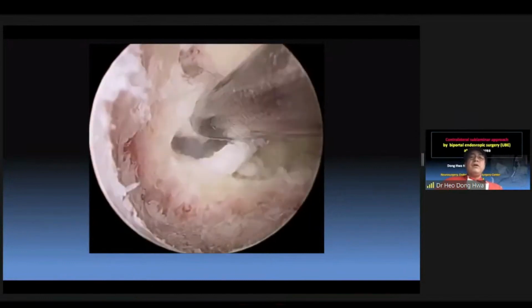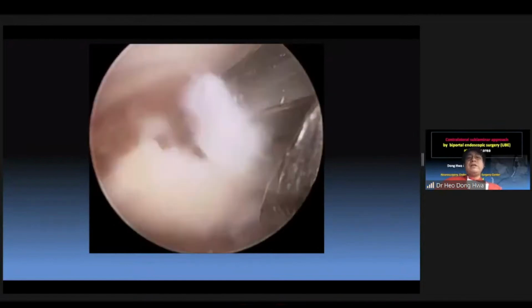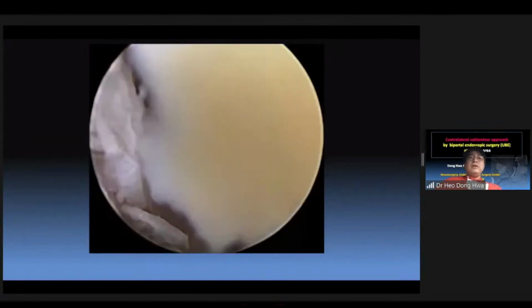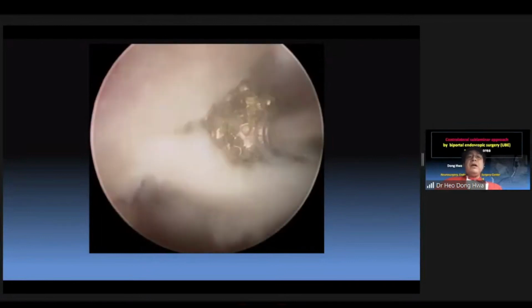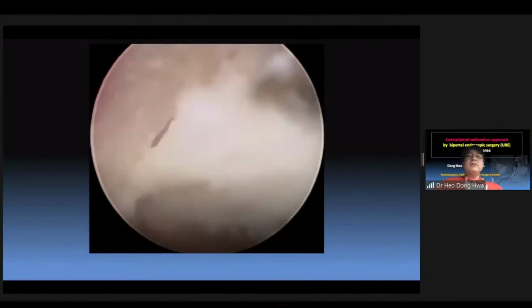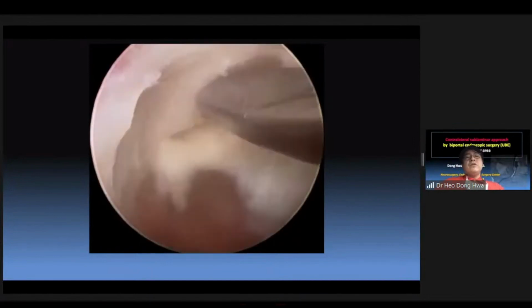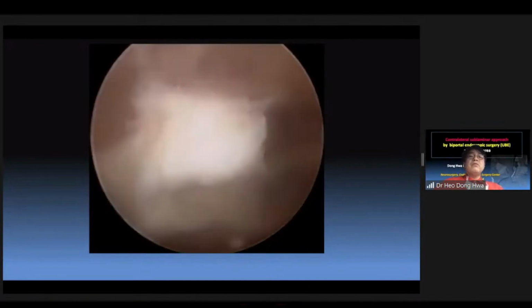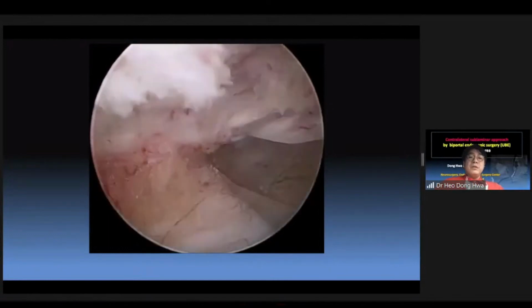Now I do the ipsilateral laminotomy, and dissect to expose the upper portion of the lower lamina. Firstly, I address the hypertrophied ligamentum flavum, and now I do sublaminar bony decompression using the diamond drill. And you can see the detachment of the contralateral ligamentum flavum. This is a very familiar surgical procedure. Now I do the contralateral central canal decompression.